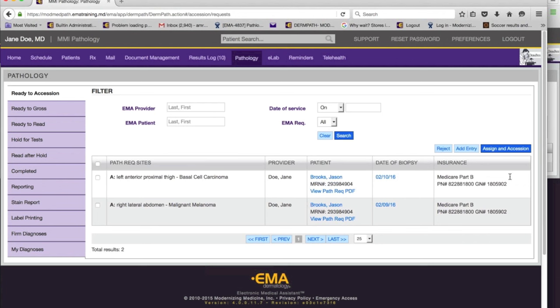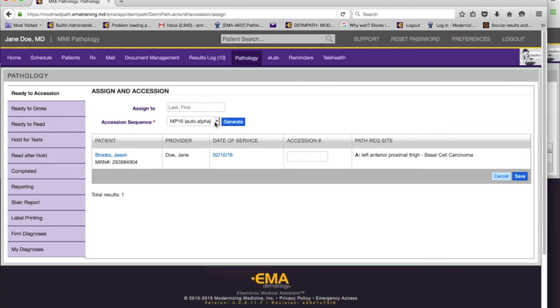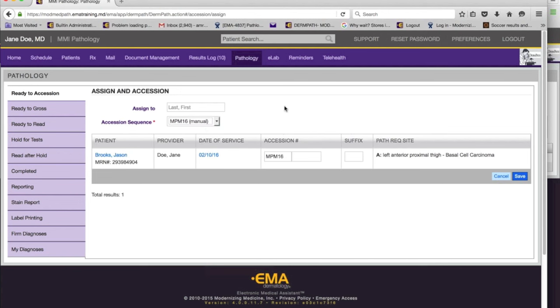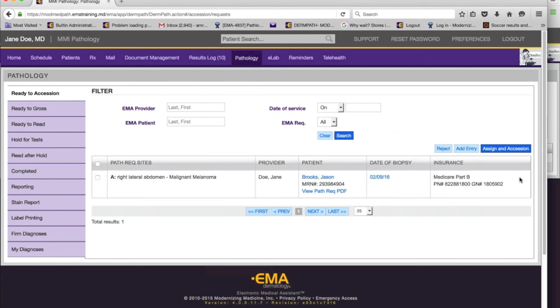I'll say save, and it's been accessioned and moved on to the grossing screen. I should show you quickly how it works for those who outsource the technical component and must do this manually: if you use the manual sequence, you enter the number manually — for example, 200-2012 with suffix A — and save. Done.